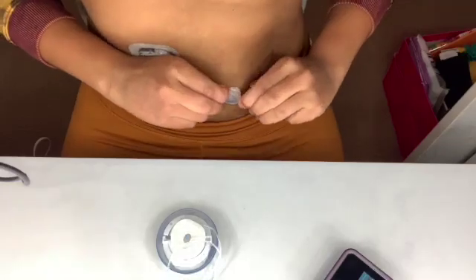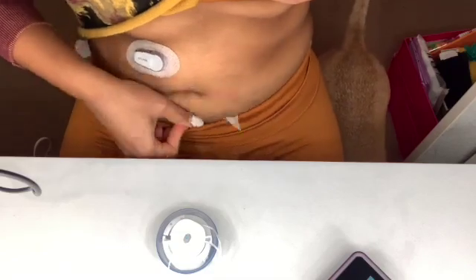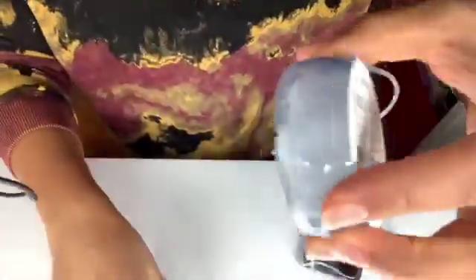insulin. So basically we're gonna press start to that, and then once that starts pumping, I like to take out my old inset and wipe it down real good with an alcohol swab to make sure it's all nice and clean. And then I'm gonna get another one and then just wipe around where I want to put the new one. There's my dog Aldi. But yeah, so make sure you don't use the same spot over again.